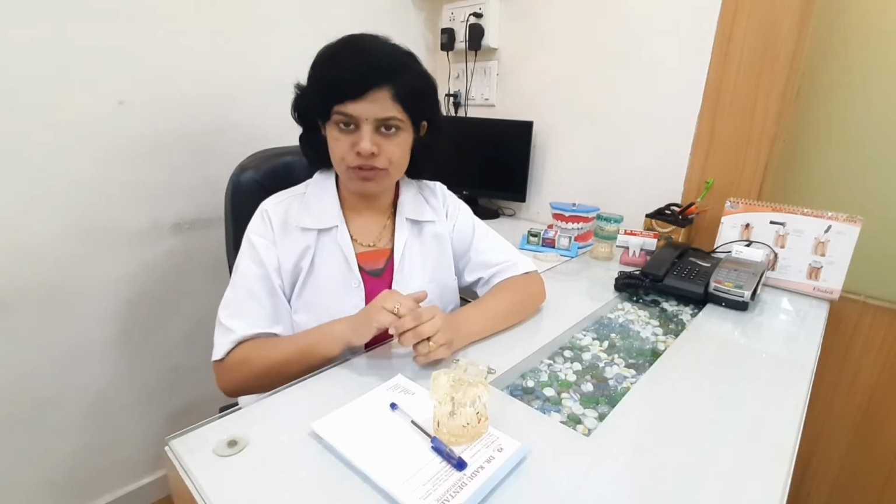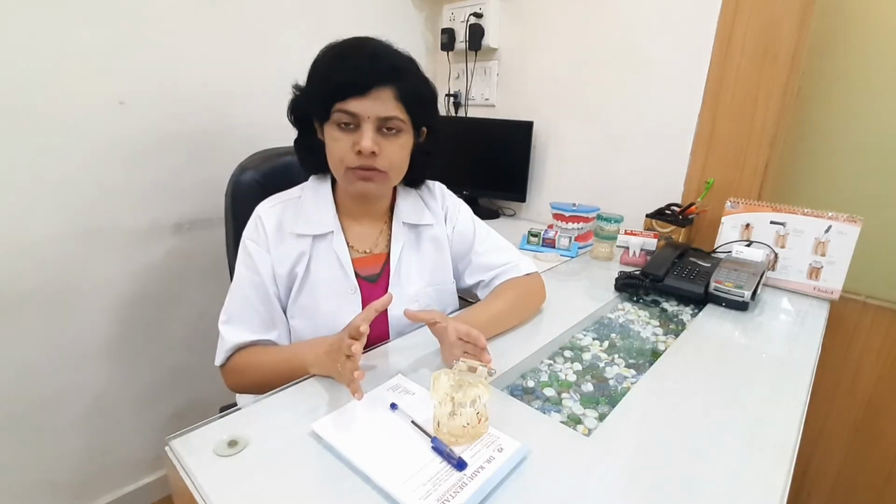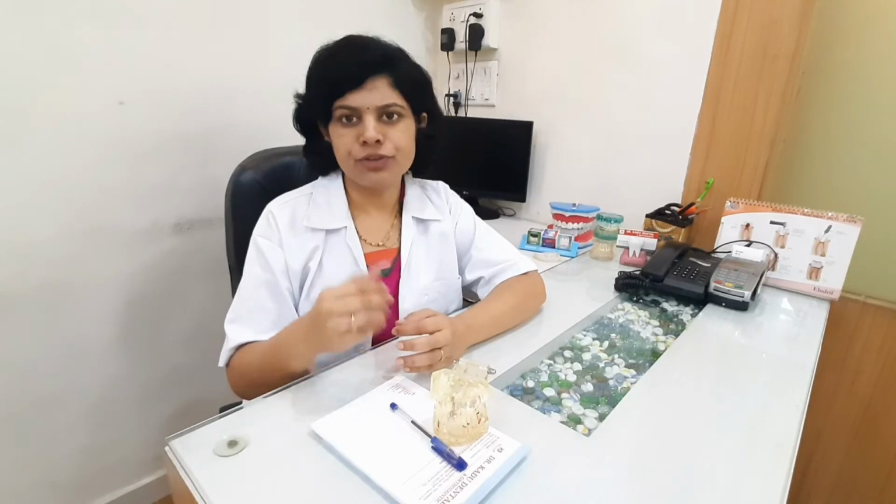Once we are sure that the implant has been osseointegrated in the bone, it has been fixed into the bone and it is stable now, then we go for the second step of the procedure, that is putting in the abutment. The abutment is put inside the implant by doing a second surgery in some of the cases. And again, the gums are closed.